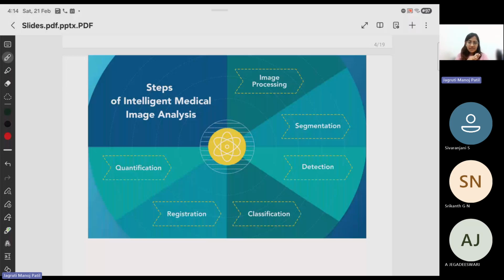Now, consider how the speckle, or the grainy texture in the image, changes when you image. If it's similar in certain areas, that means you have localized one part of tissue, and if it's different in other areas, that's different. You label those pixels. That is something known as segmentation. And then further, the entire thing is encapsulated within image processing.